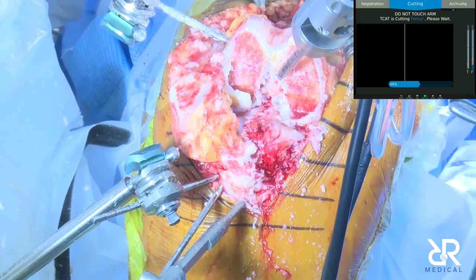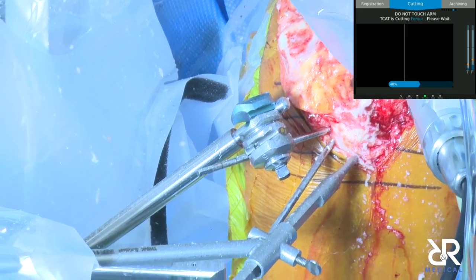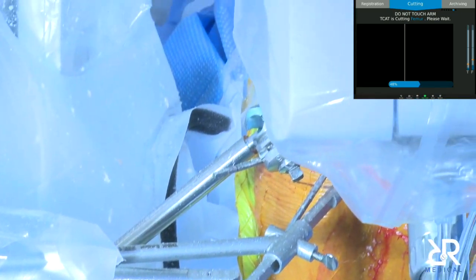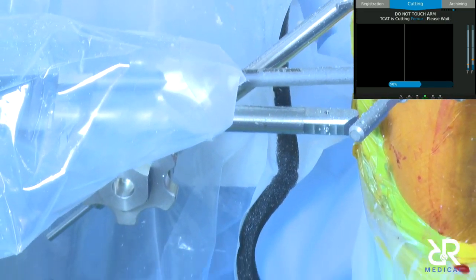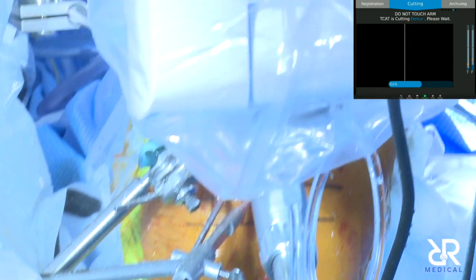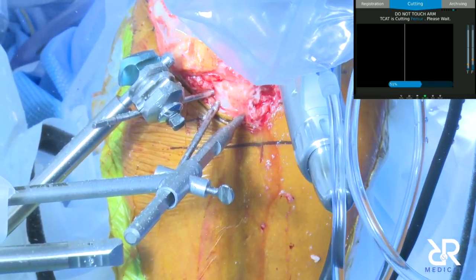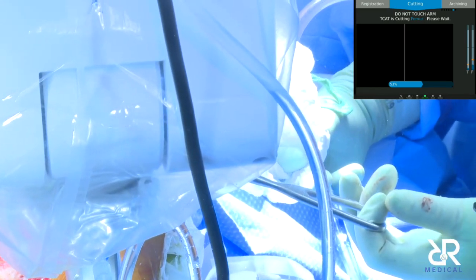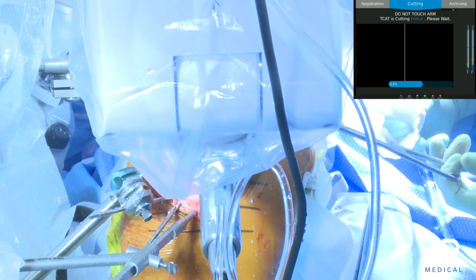So we sort of remove the debris as we go, and without shaking things up, because we don't want the BMMs to be triggered, and then you gotta start from scratch. Well, you just gotta use your recovery stuff. Yeah, and go drink coffee.